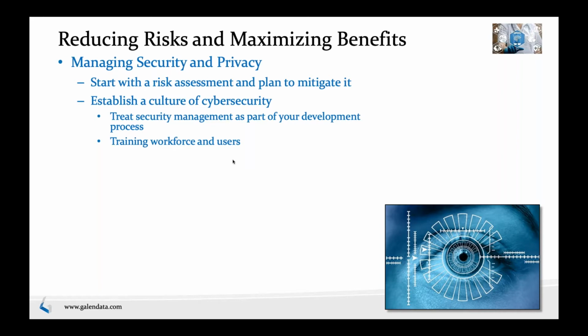We also train your workforce specifically, and maybe even your users. The reason for that is a lot of cybersecurity issues come with people. Even if you have very good controls in your software or in your solution, you may still have people leaving out pieces of information, or sharing access, or clicking on links and stuff like that. So it's very important to train your workforce, and train them repeatedly. I cannot emphasize that enough. That training is a super important aspect to keeping the cybersecurity culture in your company.